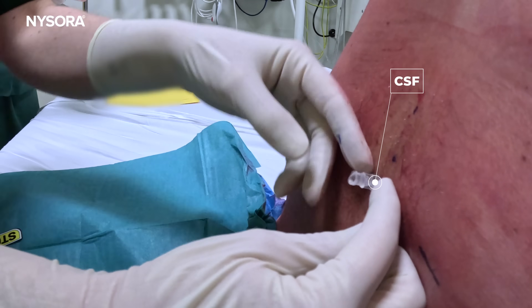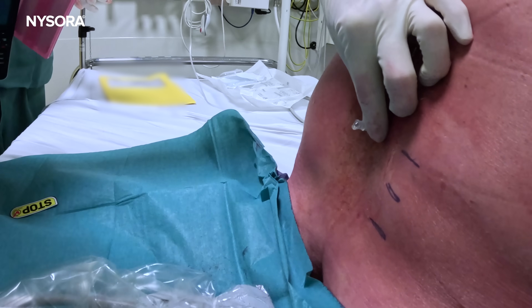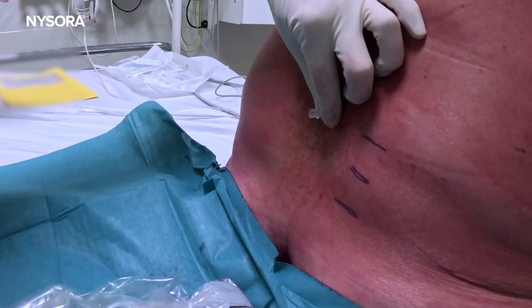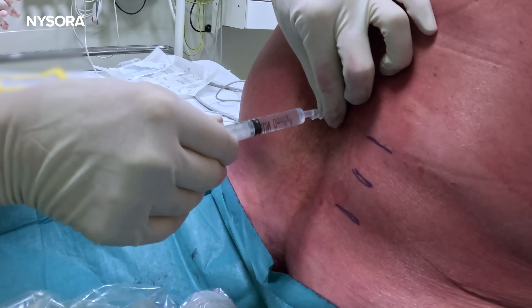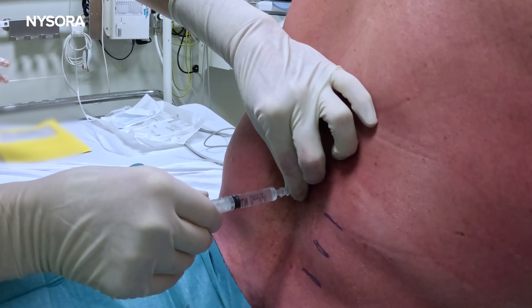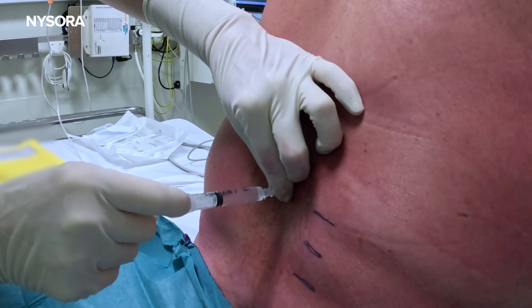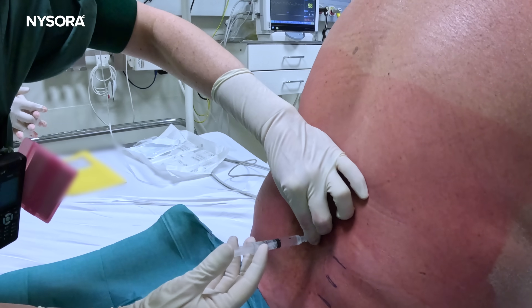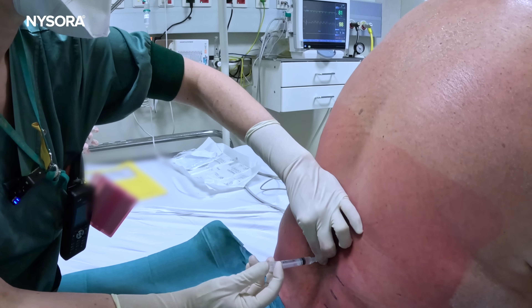It's coming back — CSF is returning. I'm going to immobilize the needle and connect. We're going to aspirate and inject. We're going to inject 10 milligrams — that's more than enough.